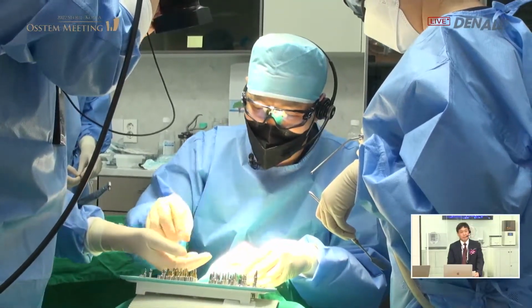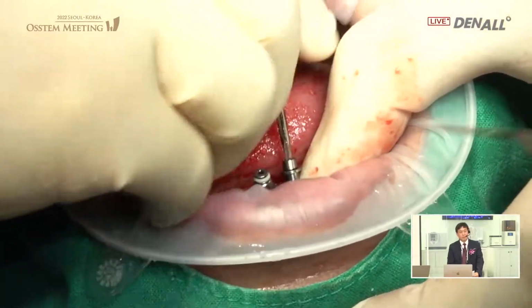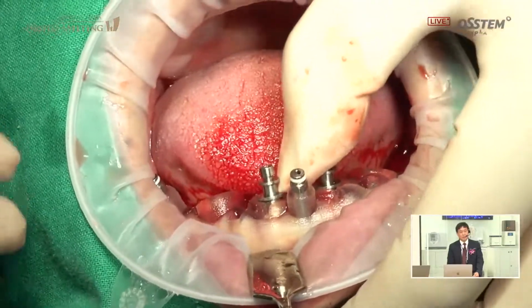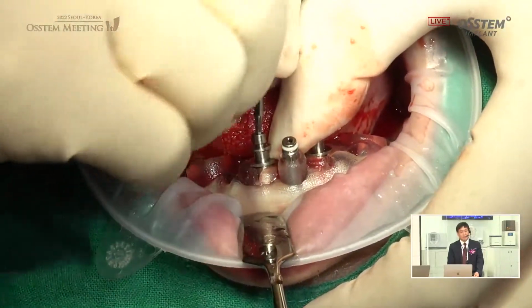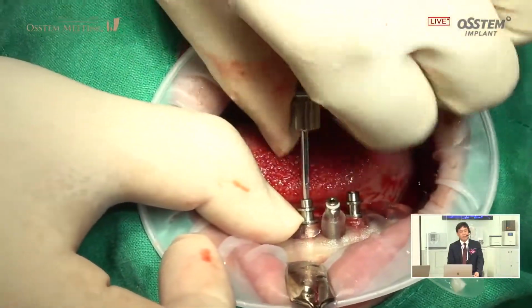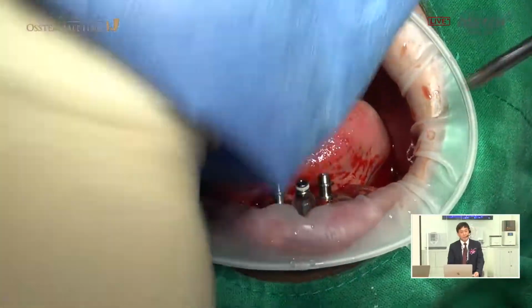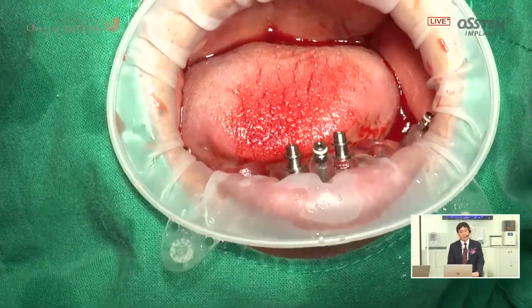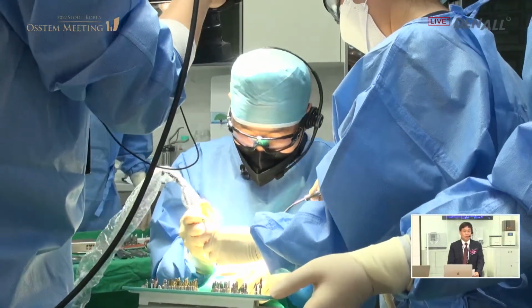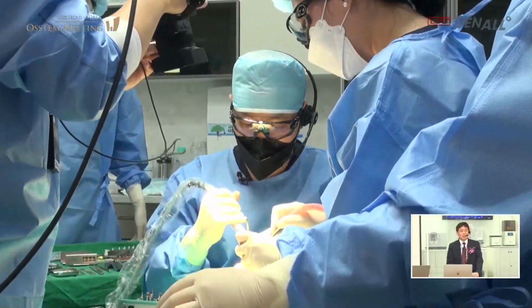In terms of depth, I'm using the implant anchor, the vertical anchor system. I'm going to additionally use a vertical anchor to place the tilted implant in the posterior area, so that the implant does not sink down in the posterior area where bone is lacking. Fixture anchor is used, and vertical anchor is used to prep the posterior sites.